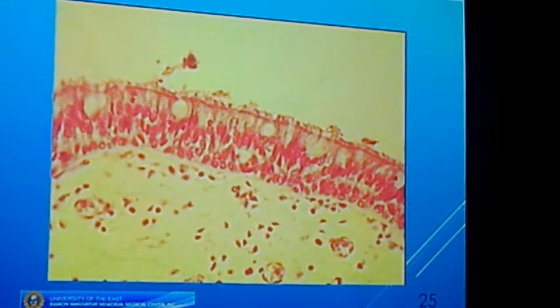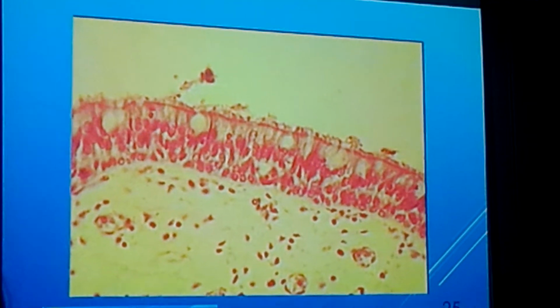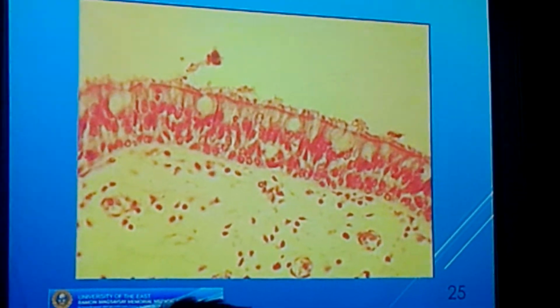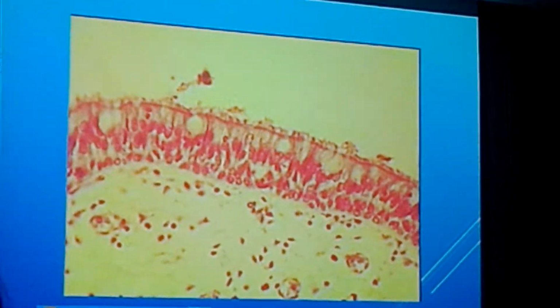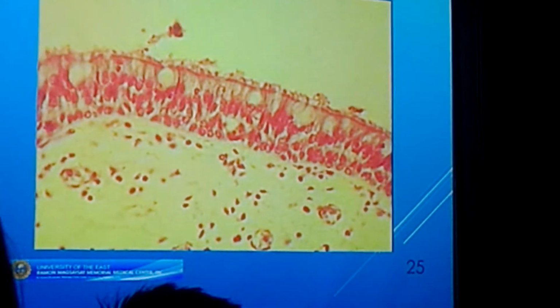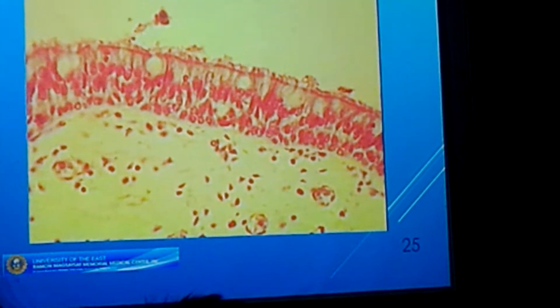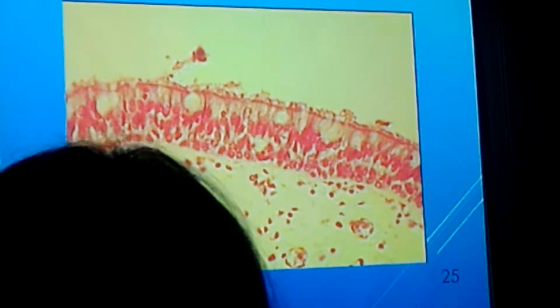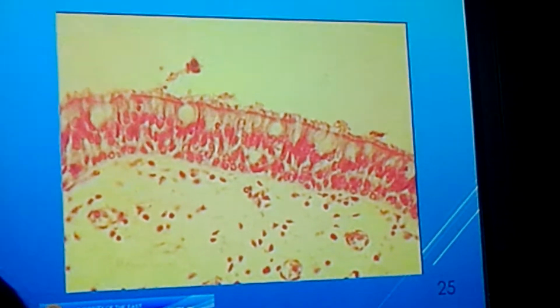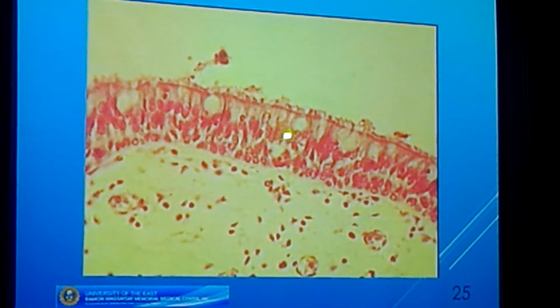So, anong epithelium yan? Pseudo-stratified. Remember, you only have 30 seconds. Pseudo-stratified. So, kailangan mabilis kayo. Pseudo-stratified ciliated columnar epithelium with goblet cells. Okay? Epithelium, our abbreviation is EPIT. Period. Right there. Respiratory tract. Pseudostratified ciliated columnar epithelium with goblet cell.